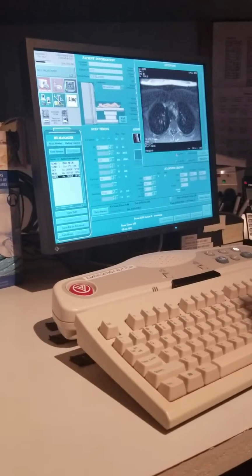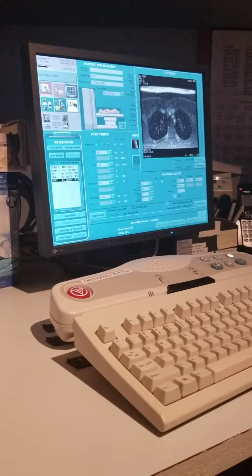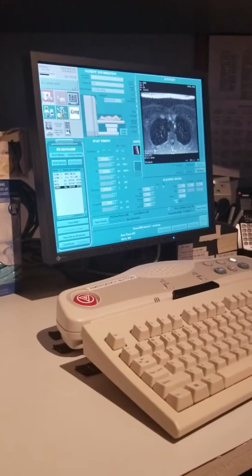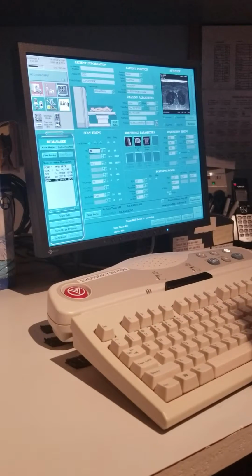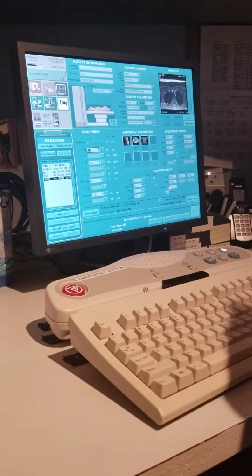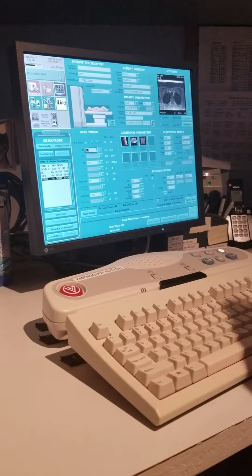3D is a higher resolution scan, but you don't cover as much as the 2D time of flight, because then it's going to be prohibitively longer. It shouldn't be 2.5 millimeters thick, but it is. See how it's got an overlap? Usually it's got slabs. So you've got a total of 5 slabs with 20, so it makes pretty good coverage. So go ahead and go into graphic.